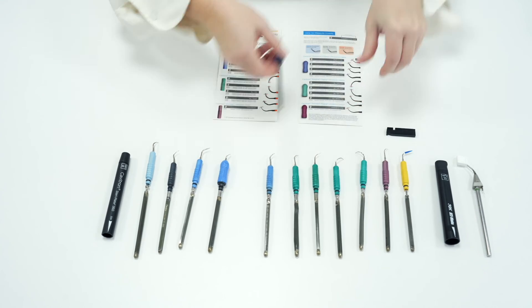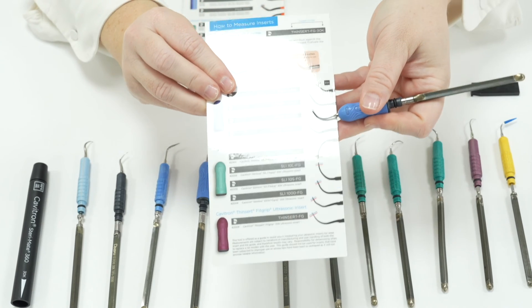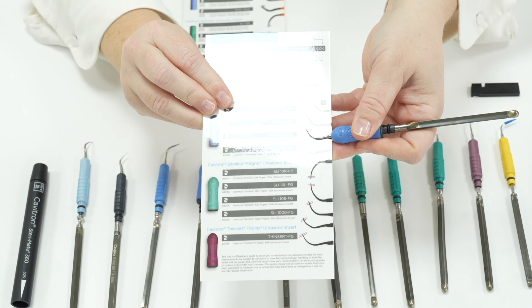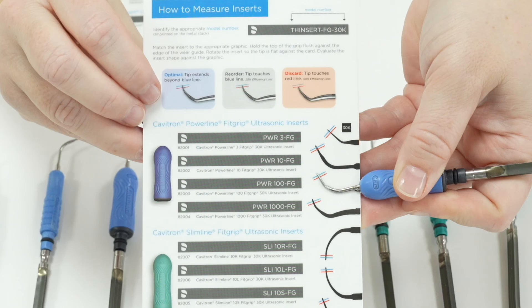For example, this insert is an FSI Powerline 100, which is here on the card. I place the insert along the black line and it should not deviate — if it bends away from this line it has to be discarded. The insert should extend beyond the blue line, meaning it is working at full efficiency. If the insert is short of the blue line it has lost 25% of its efficiency, and if down to the red line it has lost 50% of its efficiency.